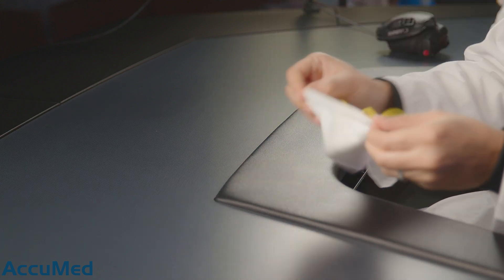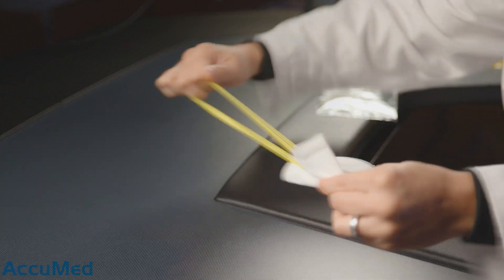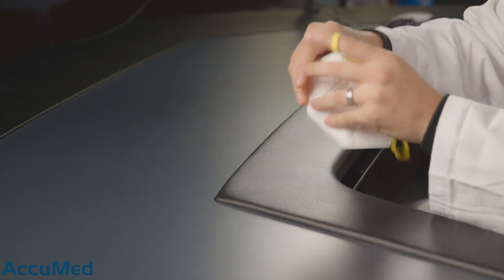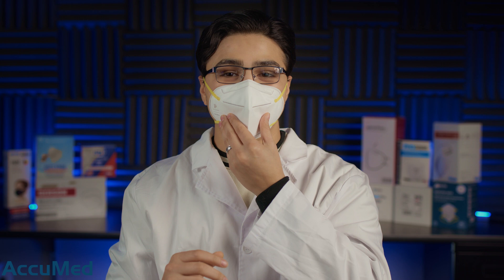Now let's test out the headband loops. It's alright construction — not bad at all. The nose wire isn't the stiffest. We're going to run them through the test and see how they hold up. Putting this one on and sliding that one on the back of my neck. So it is pretty secure, however you can notice there's a lot of collapse, so the breathability is not the best.